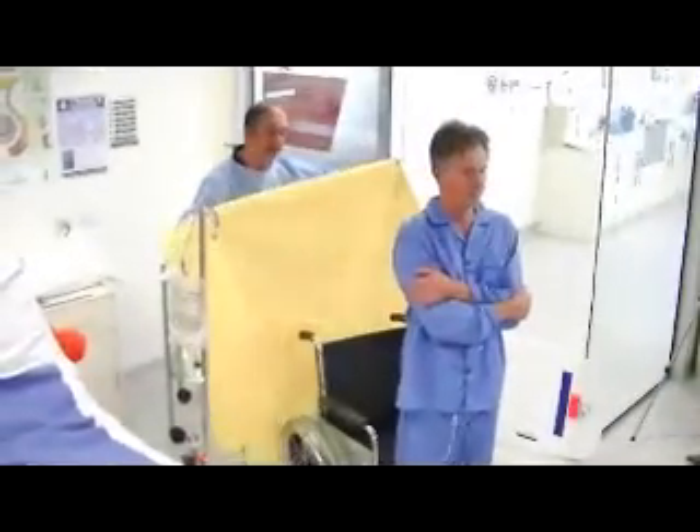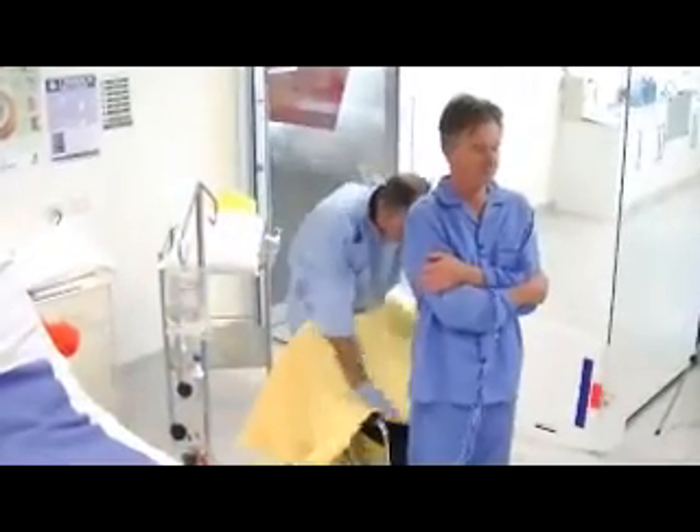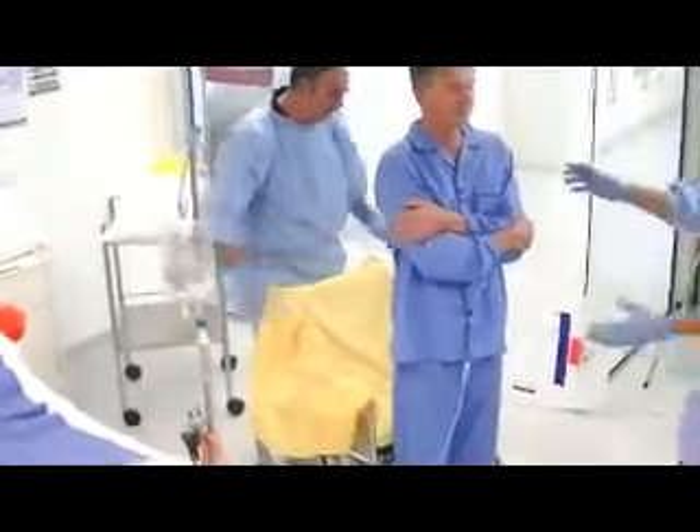Introduce one slide sheet, fold it in half, with the fold towards the patient. Do not have the slide sheet over the edge of the wheelchair.